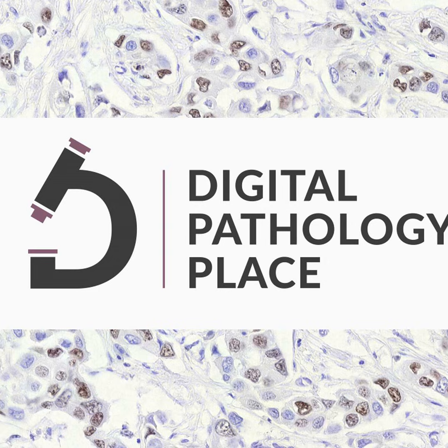valuable. And then you move on to the cell analysis, where we're trying to detect nuclei and measure cytoplasmic expression, membrane expression. The AI models, I feel like, have really been a game changer in the last 5 or 10 years of being able to accurately segment cells. If you look at a tissue like colorectal, where you've got these really densely packed nuclei and they're elongated and they're all right next to each other, the AI models are very good at capturing those. They still have their challenges. Throughout that whole workflow I described, there are challenges at each step.